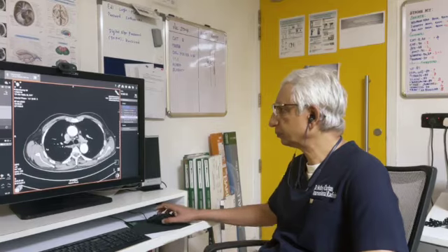So just yesterday we had to treat a patient with hemoptysis. The treatment was done by one of our doctors who are training with us, but we planned this case together to ensure that we could successfully treat this patient. So this is the CT scan.